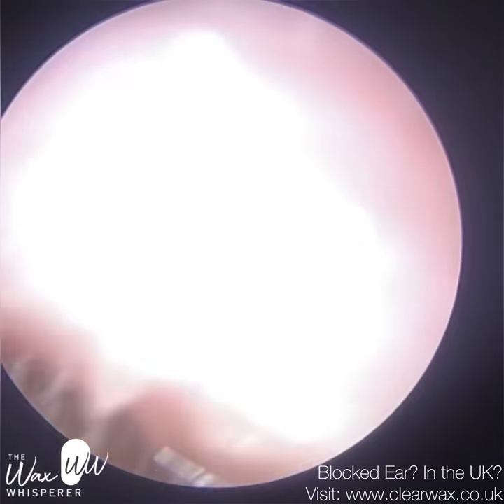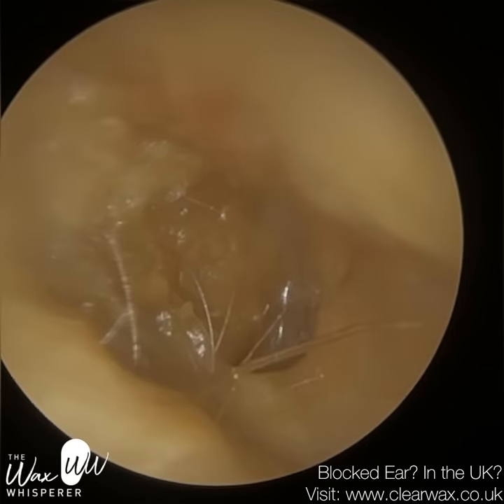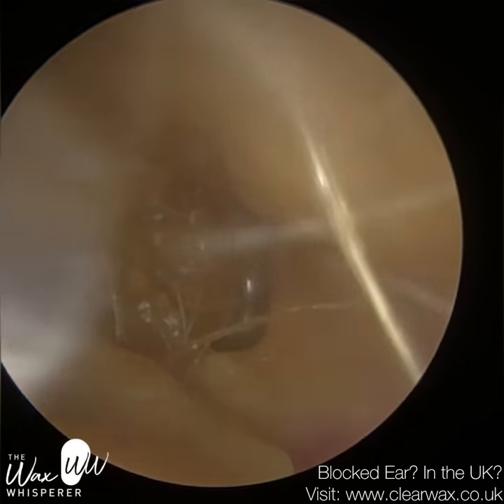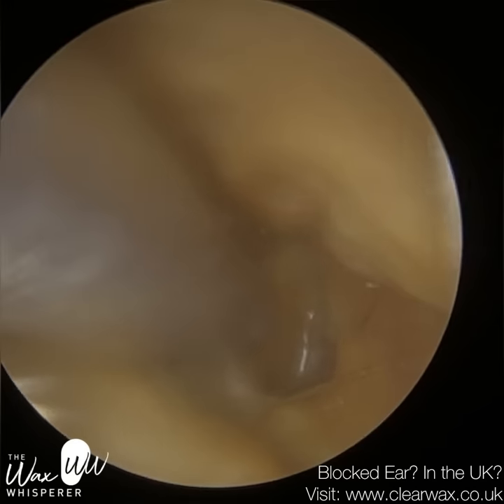So we're trying to remove this without making contact with the patient's ear canal. Because of their condition, eczematous otitis externa, they do have a bit of tenderness and underlying pain of the ear canal, which makes it just more difficult to remove. Their entrance of the ear canal is quite narrow as well.